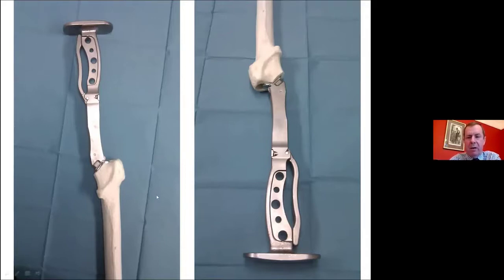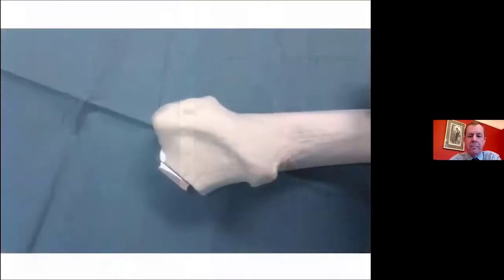In an older female with a softer cancellous bone, there'll be more of a sudden stop. It's important to be aware of that, because you reach that stop and you will not be able to sink the broach any further. With a younger male, you can normally, with a lot of effort and risk of developing tennis elbow, impact a bit further.